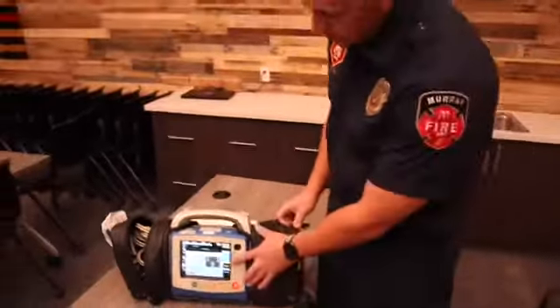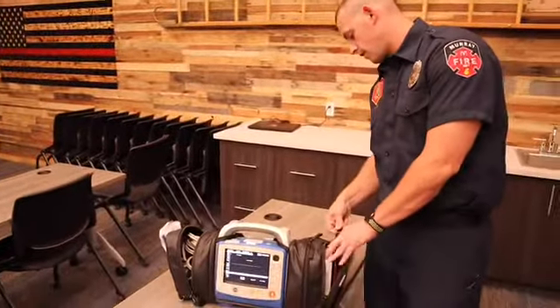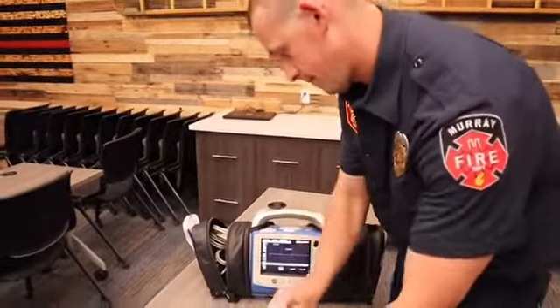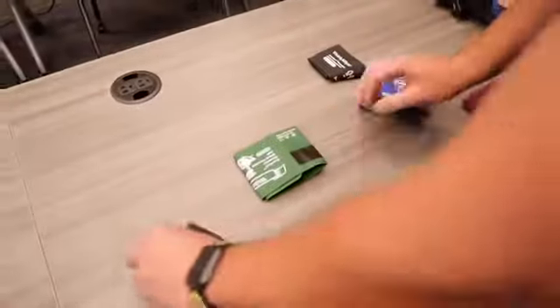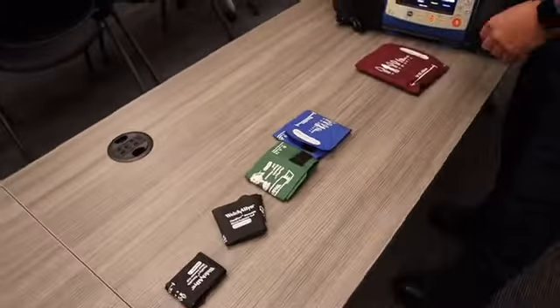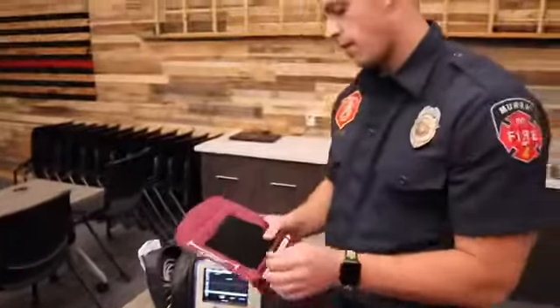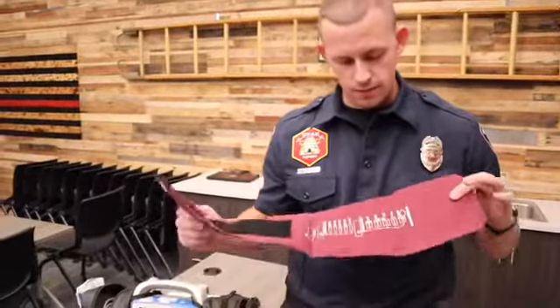Now we'll go over the different cuff sizes that we carry. You'll notice there are several different sizes. What a lot of people don't know is there's actually a right way to put this on.